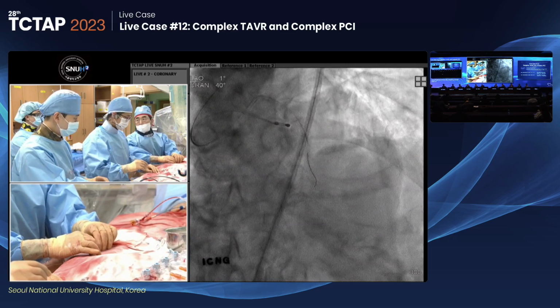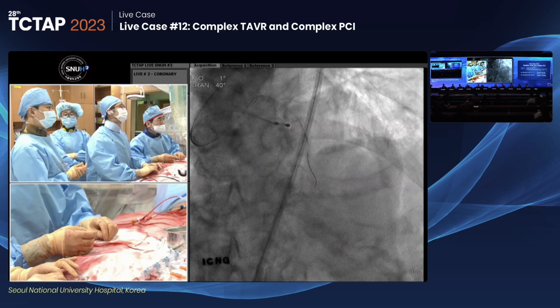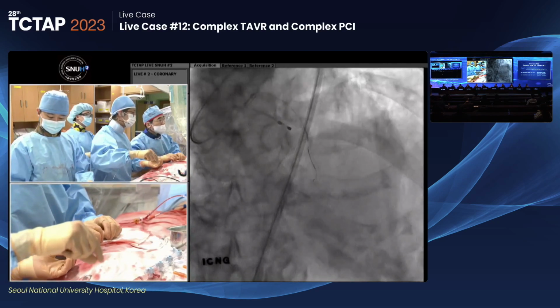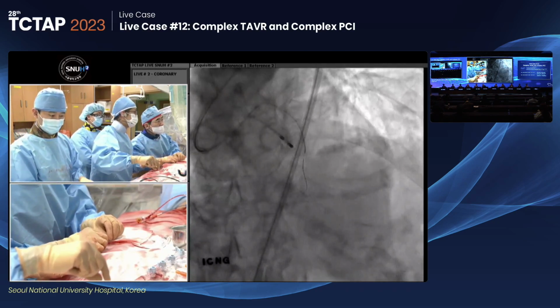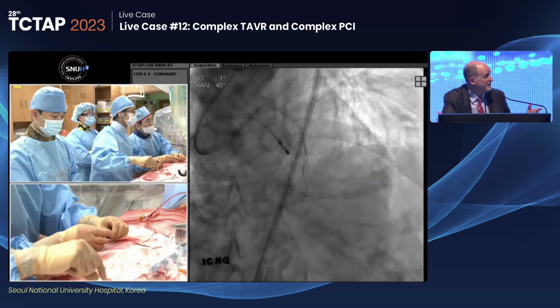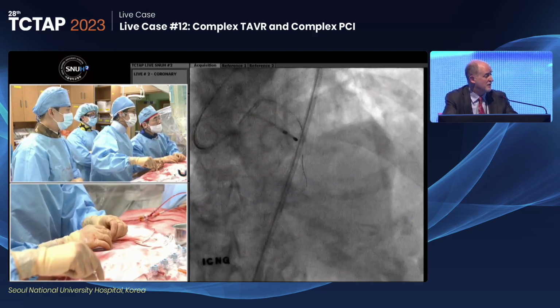And in this case in the US you usually do Shockwave, right? Well, I think Shockwave would be very difficult to deliver in this anatomy without atherectomy first. Sometimes you combine Shockwave afterwards. Also, how about MCS?